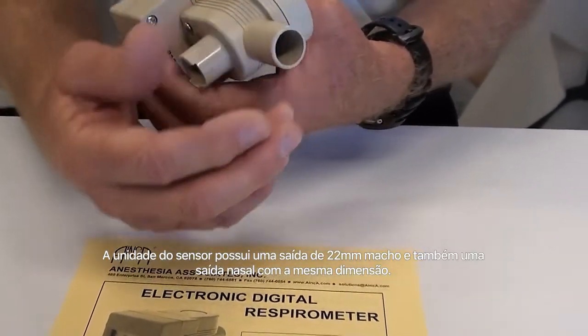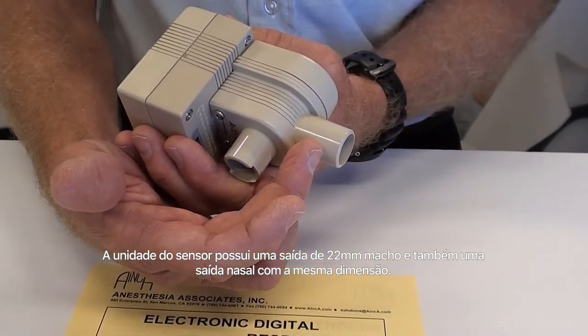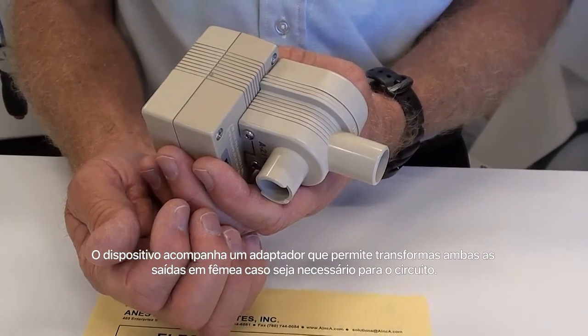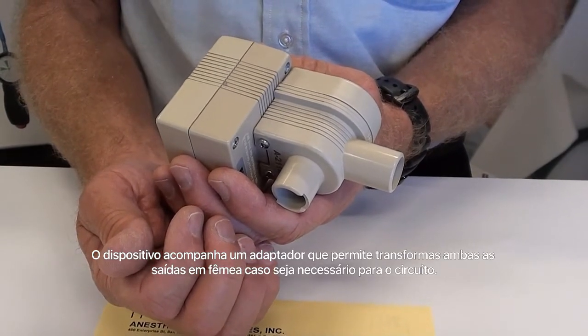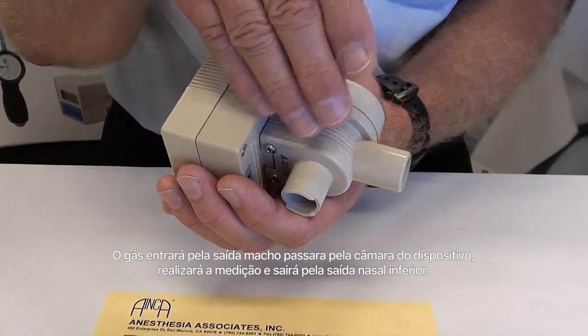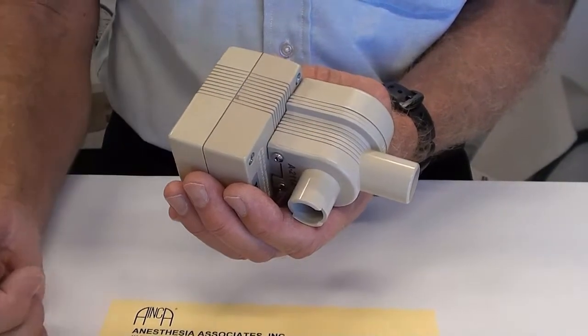The sensor itself has an inlet nozzle that is 22 millimeter male size and an outlet nozzle as well, which is also 22 millimeter male. The device comes with an adapter that allows you to turn either of those into a female connector if necessary for your circuit. Traditionally, the gases will come into the device through the chamber, the measurement will be made, and the gases will exit out the lower nozzle.